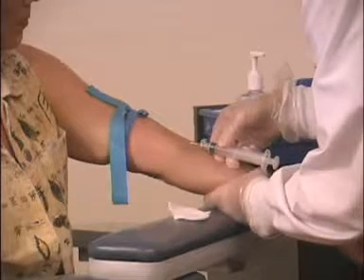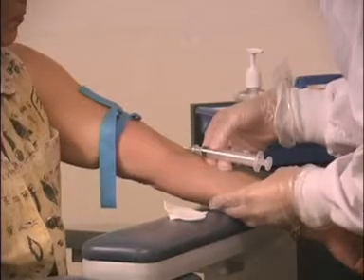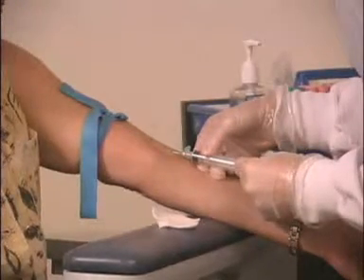Warn the patient. Line the needle up with the vein and insert it into the skin using a smooth forward motion. Stop when you feel a decrease in resistance, often described as a pop, and press your fingers into the arm to anchor the syringe.